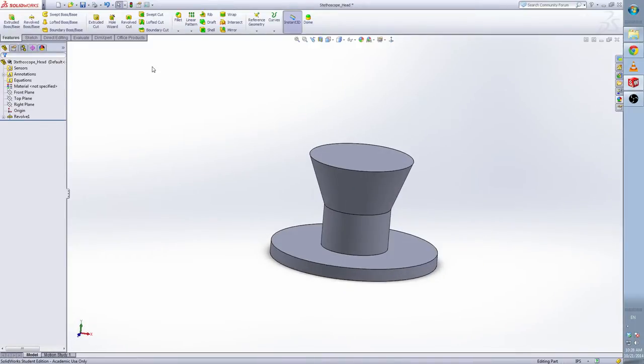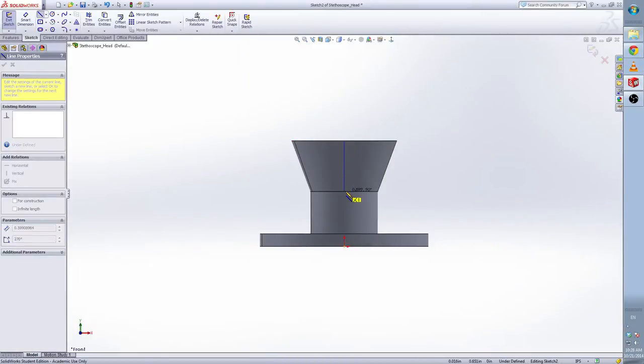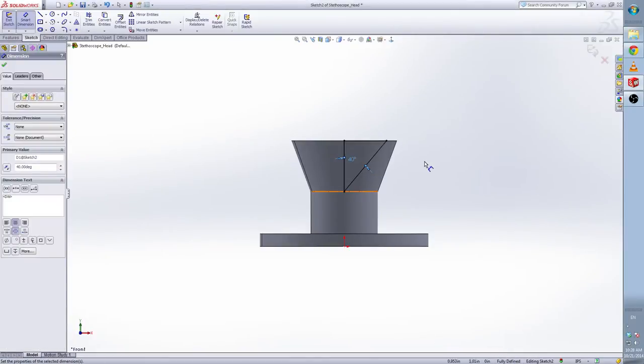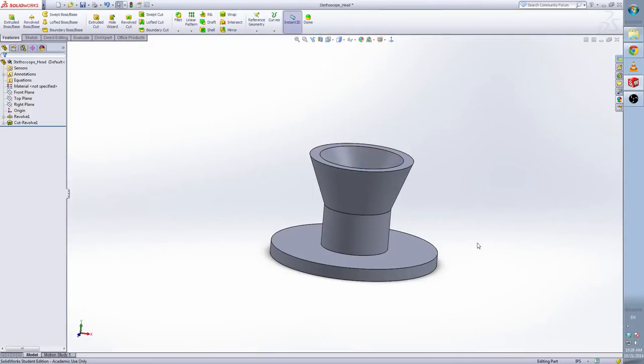Now do a revolve cut in the top part. We select the front plane again. Do the two center lines — the middle center, the middle point of these two lines — and I can connect like this. The angle of this is 40 degrees. Now I fully define this and select the axis. You can see the preview is like this.